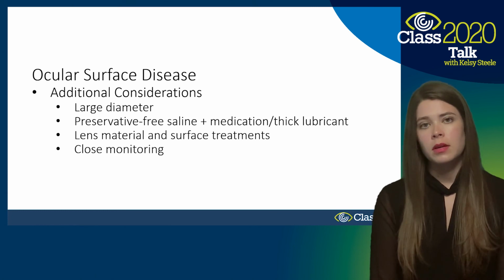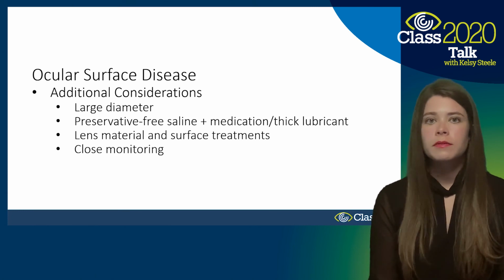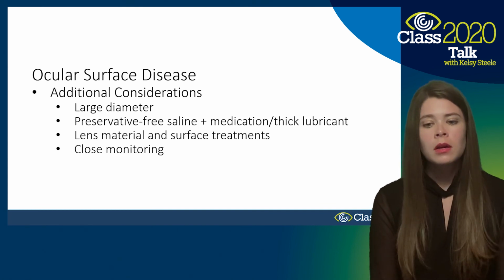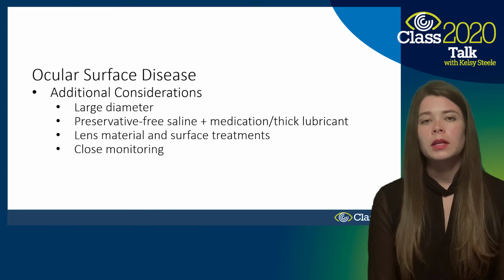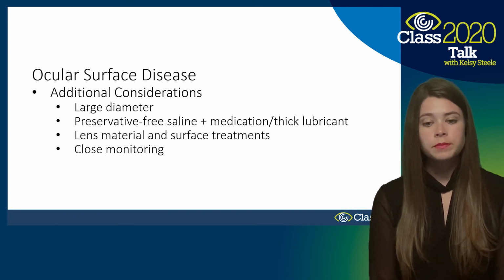Other patients may be using some other kind of tears that they got from their ophthalmologist or something. So you want to make sure you're being really careful with what they're putting in the bowl and how they're taking care of their lenses.